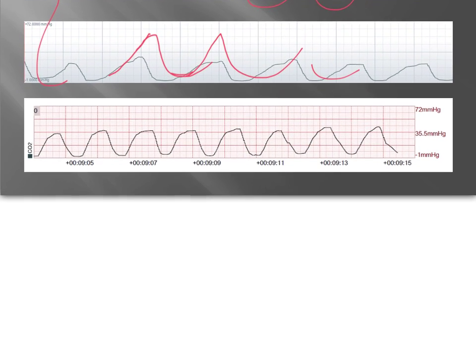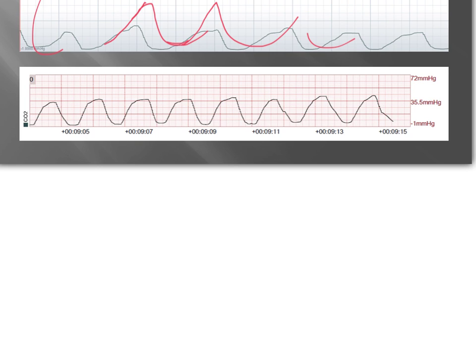And then we have this other waveform here, and we can see that this really mimics mostly that delayed exhalation. However, it's much later in the game, as we can see here. Our waveform is actually relatively upright, and then we get some sloping at the end. And we can see that's relatively consistent throughout as well. So that gives me a good indication that this waveform is not an aberration, and we have some type of problem that we need to address regarding delayed exhalation and or bronchospasm, mucus plugs, what have you.